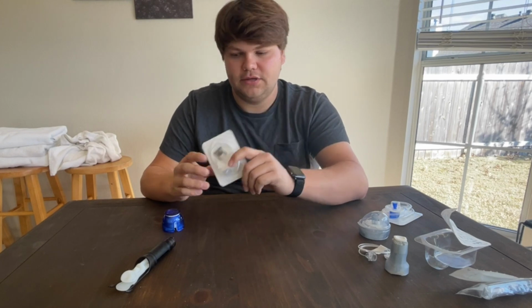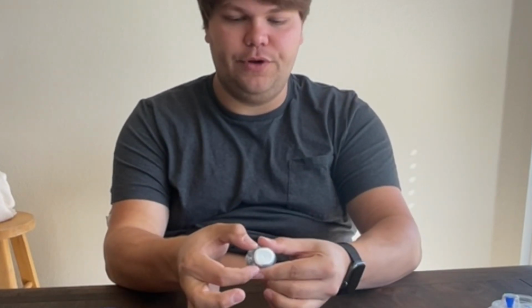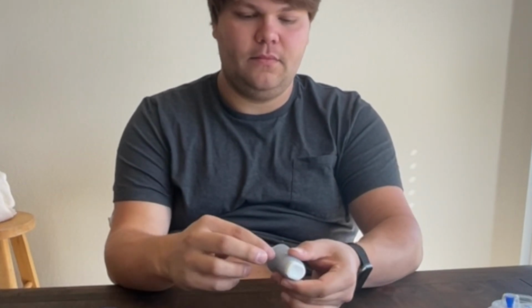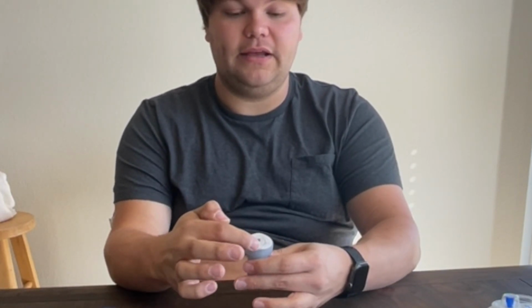So, like I promised, we are going to do the Mio Advanced. I'm going to put it on my abdomen, and I'm going to share that with you guys. So we're removing the safety. You're going to remove the adhesive. It kind of does a little spiral. Let that kind of get back flat. I'm going to lift my abdomen up here for you guys. I like to have mine to where the tubing goes to the bottom. So I'm gonna place it like this, take my finger like an EpiPen, apply pressure, little click, it's inserted. This can be discarded. Now you can see the infusion set here.